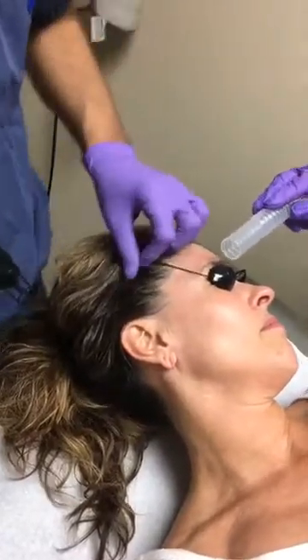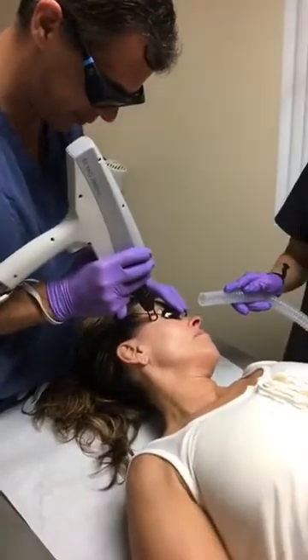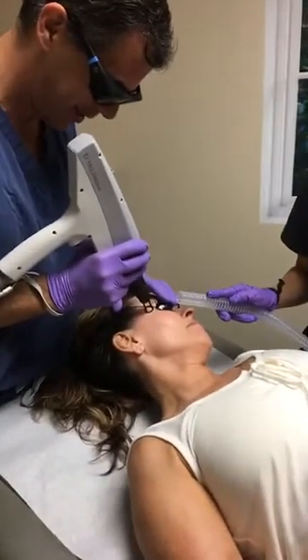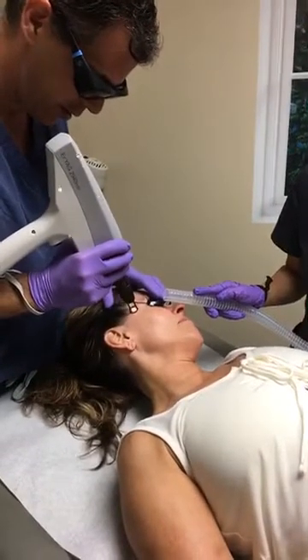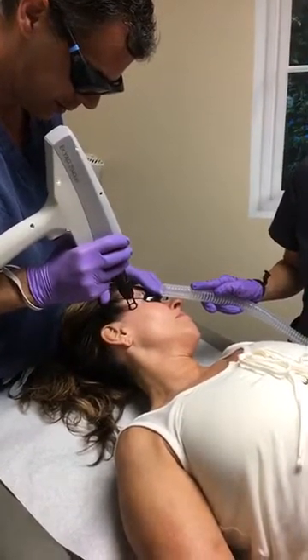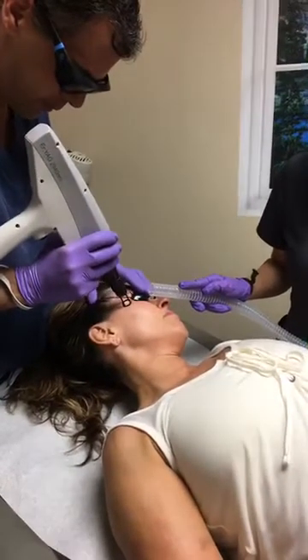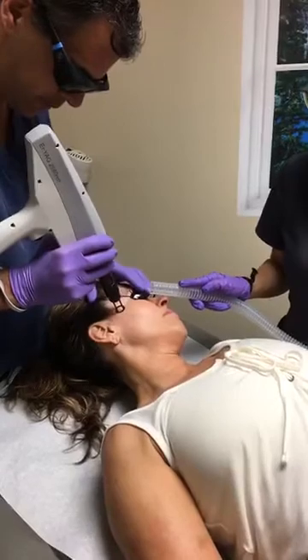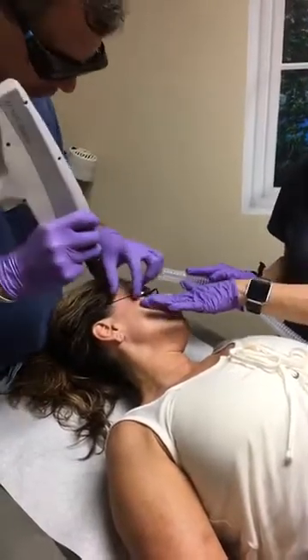Natalie is running the video, so if anyone is watching and has questions, you can type them in. She can't see anything — Natalie will tell us what the questions are. The whole procedure here is going to take about 20 minutes to do a full face.